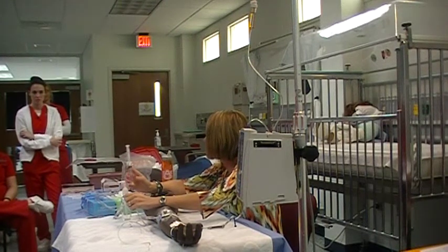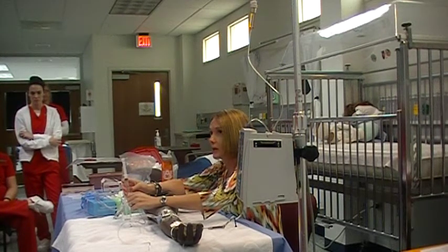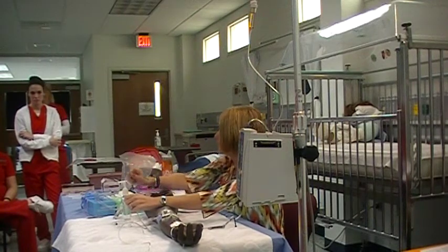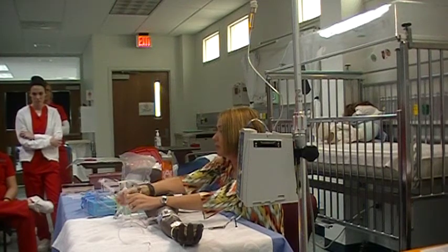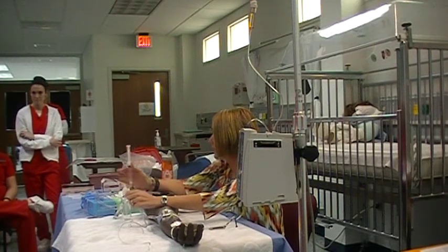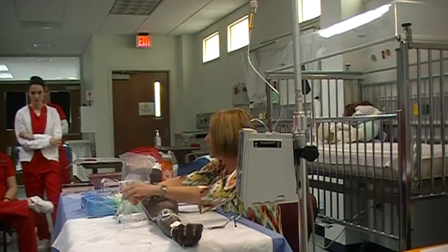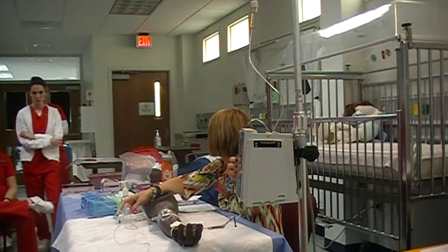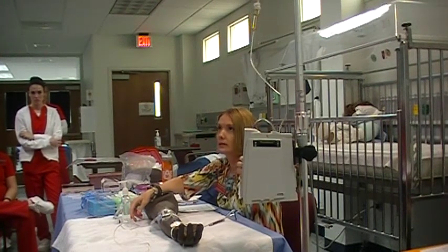Okay, I'm going to go ahead and flush with 10, and you verbalize to me, I'm going to flush with 10 mLs of fluid, and at the same time I'm going to make sure my IV is patent. You would give your medication, again, whatever time you told me, then go ahead and put another 10 mLs on there, clean it, and give that fully. Once you've done that, you open your line back up and you start it back. Any questions about that? Are we pausing or turning off our pump? You can pause it. Just pause it.